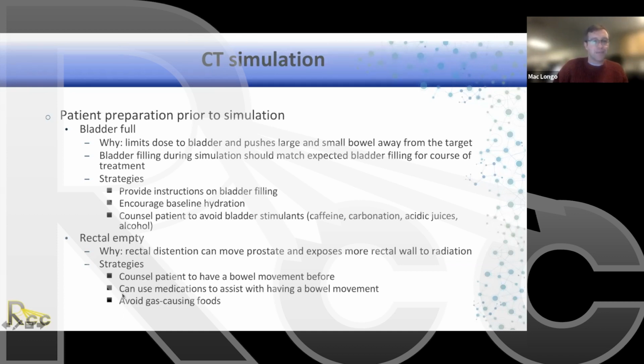on a daily basis. Similarly, with rectal emptying, the ESTRO guidelines recommend consideration of a laxative prior to CT simulation to empty out the rectum. And again, we want a relatively empty rectum to avoid overlapping the high dose of radiation with the anterior rectal wall to limit rectal toxicity.